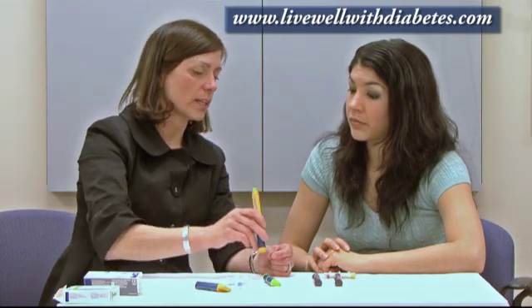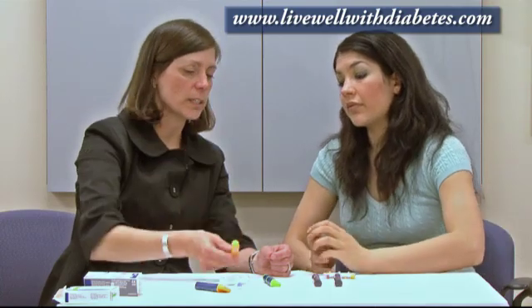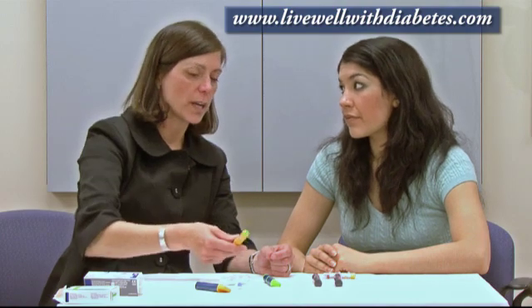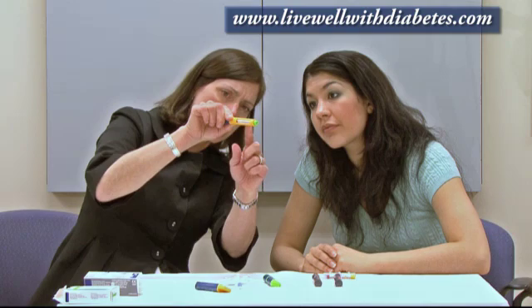It's important to mix it completely. How to mix it is to go up and down at least 10 times. Some people go up and down like this, some people like that — the whole idea is you want to mix the insulin completely. You can tell when you've mixed it all the way when the insulin looks like skim milk: no clumps, all one color. So the first step is to mix the insulin with NPH.